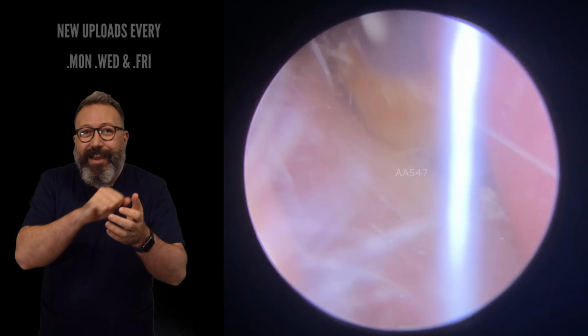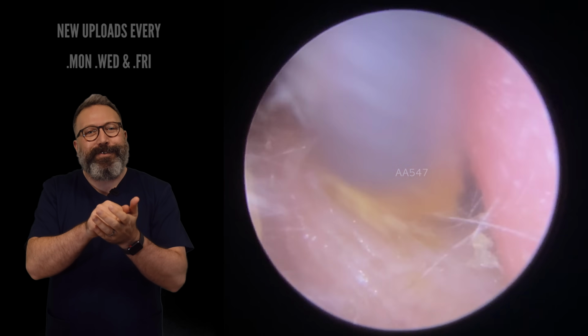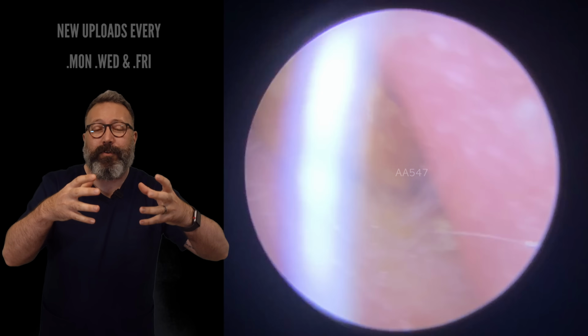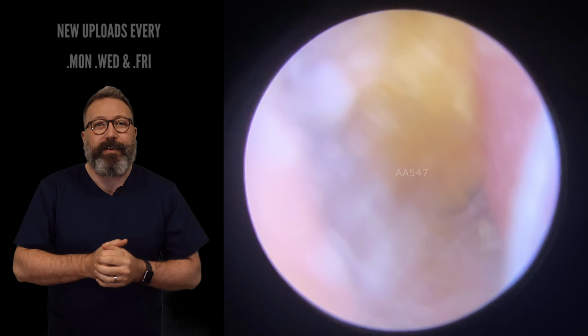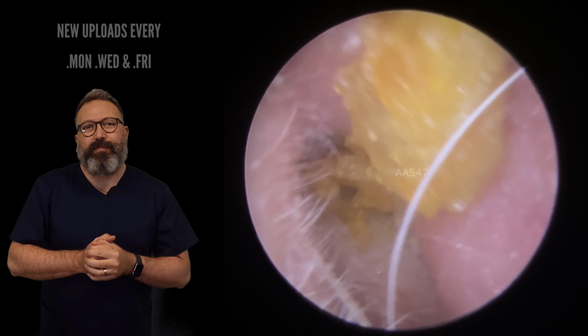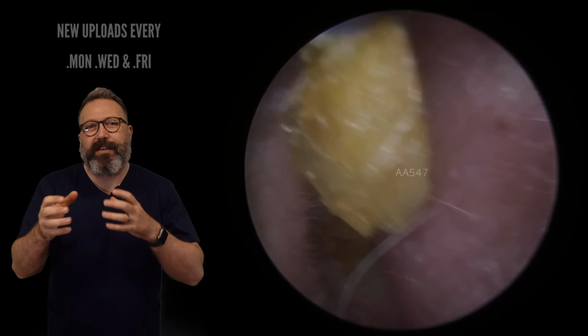We're sort of turbo wiggle. We're really wiggling those socks off to get this out. And as we're making these circular motions, we're detaching that skin from the canal wall, and then we're bringing it down the canal. There we go, look at that wiggle go. And then as this starts to come away, you'll see it's brought that next section of skin with it. So we've managed to detach that.